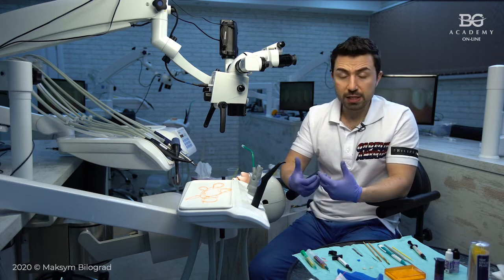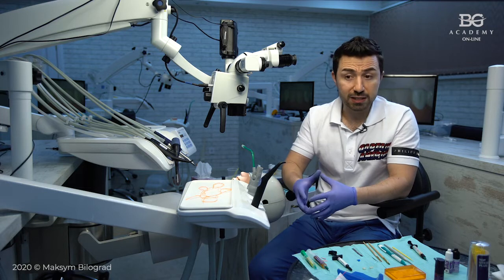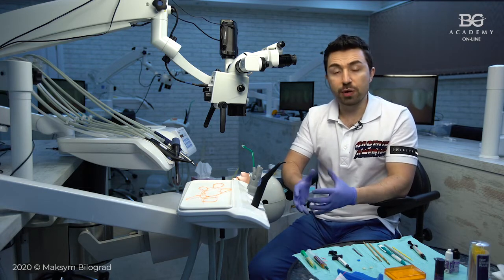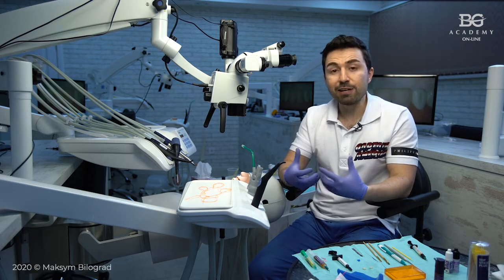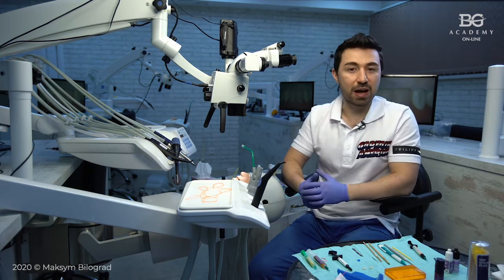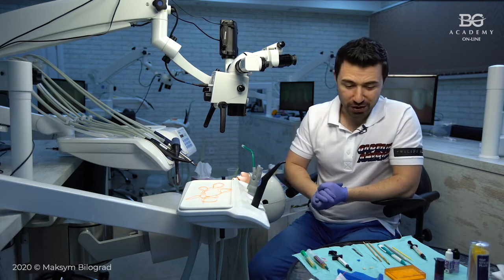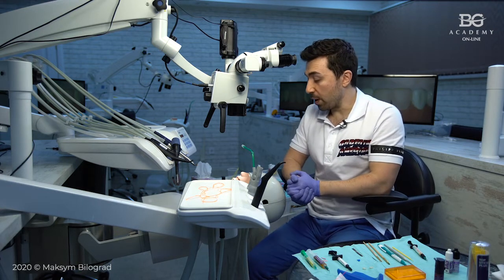We did some clinical aspects of veneer preparations, like imitating class 3, class 4, class 5 caries defects, and showing step by step how we prep veneers in those kinds of clinical situations. And now it's time for bonding. Okay, so this is another episode of our long and powerful veneer series. So my friends, let's go directly to our program.